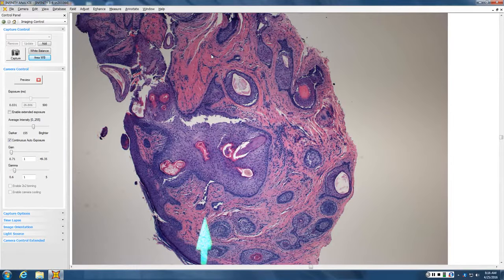What does this little thing look like over here? Like hair follicles. Like a mama follicle and a baby, and I'm just missing the cut. It's a mama and a baby in an oblique section. Okay. So this is big mama follicle, and these are all the little babies. They have an inner root sheath. They have papilla, so you know they are miniature but fully formed follicles.